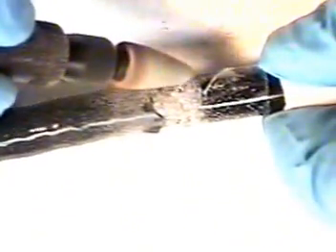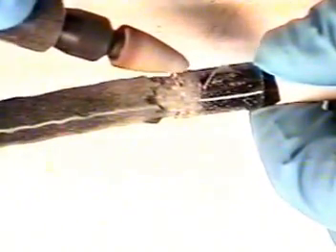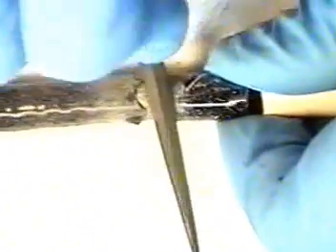If necessary, turn over the endoscope to have easy access to underneath to file off the glue. Be sure when filing off glue to do it in exactly the same plane as the insertion tube and not to cut any deeper into the insertion tube itself. Again, if you don't have access to a Dremel tool or are uncomfortable using it, use a plain file to file off the glue.